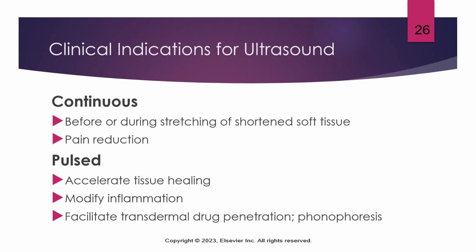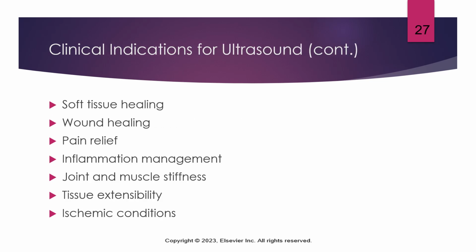So there's a ton of different drugs and medications that we can use with this kind of pulsed ultrasound in the form of phonophoresis. So again, here are the clinical indications for ultrasound, just in a little bit more of a listed format. You may want to look at those and be familiar with the most common ones that we're going to be using.